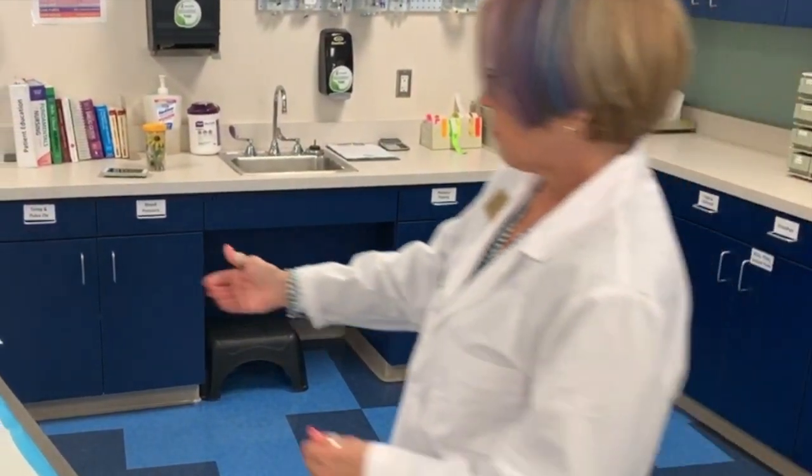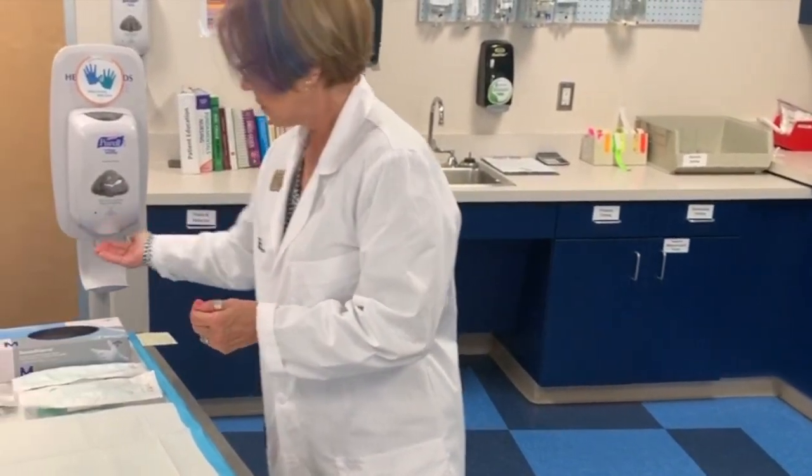We want to finish with performing hand hygiene. And then before you leave the room, always get in the habit of asking your patient if there's anything else that you can do for them. All right, that's it, starting an IV. Hope that helps.